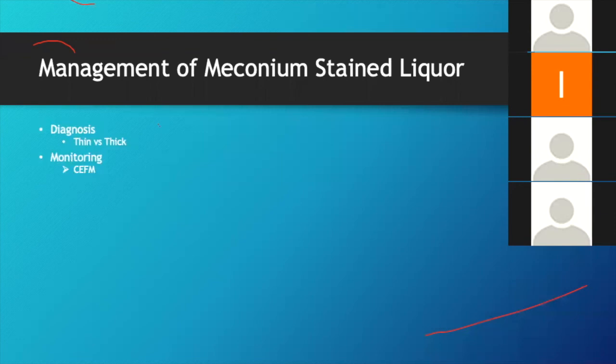STAN. What does that mean? I mean, a STAN event. Does STAN help you with meconium? What does STAN look for? Hypoxia. Not infection and not chorioamnionitis. So why am I insistent on continuous monitoring? If I said that I just can pick it up with intermittent auscultation. Oh, but it's associated hypoxia. I can pick that up as well with intermittent auscultation.